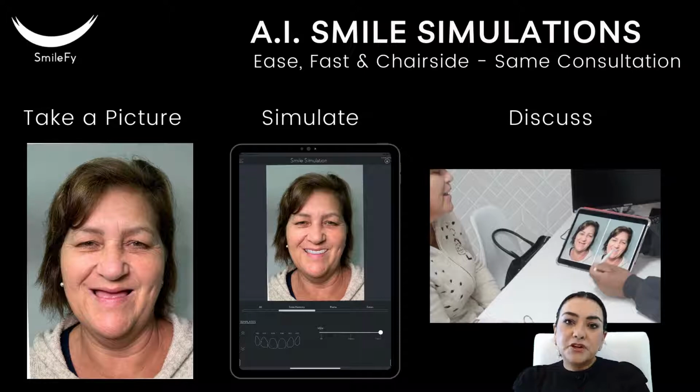We took a picture and we explained to her that we have artificial intelligence, and this will help us give her a real experience about the potential outcomes that she can get from this treatment plan. So we took the picture, we placed the frame, we selected one shape, and we showed her. When you show the before and after picture, it's about the patient.